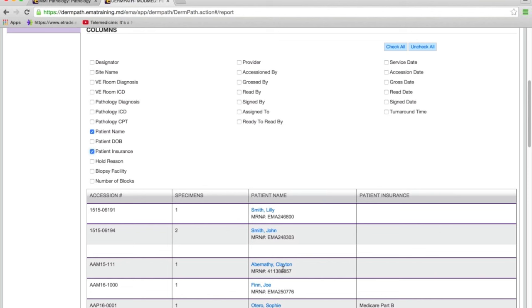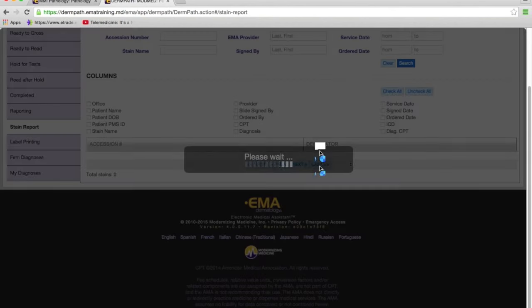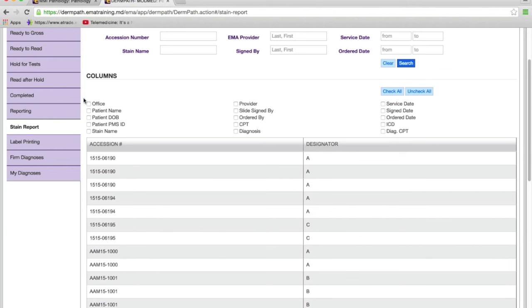Is it in the grossing screen? In the read screen? In the completed screen? Who has worked on it? We audit everything — the person who accessioned, grossed, read, signed, et cetera. All of this is logged, so you can also use this to track productivity: how many cases were grossed, how many were accessioned, and so on.